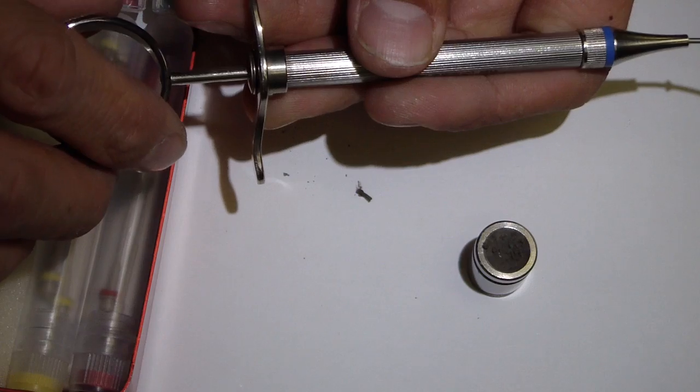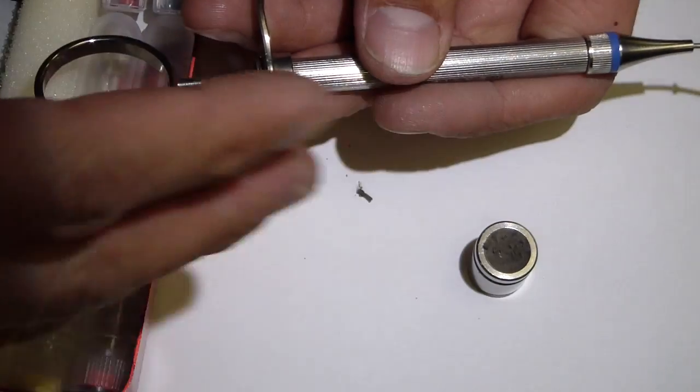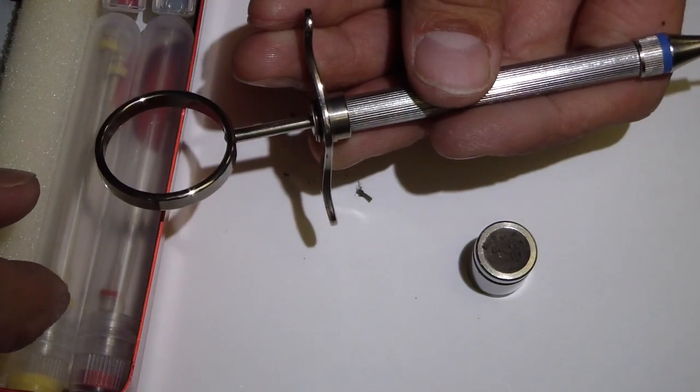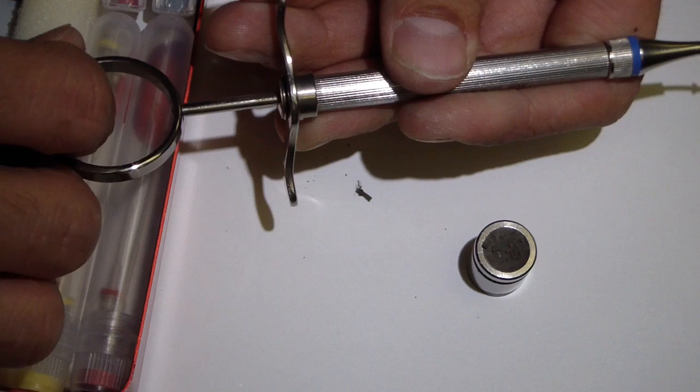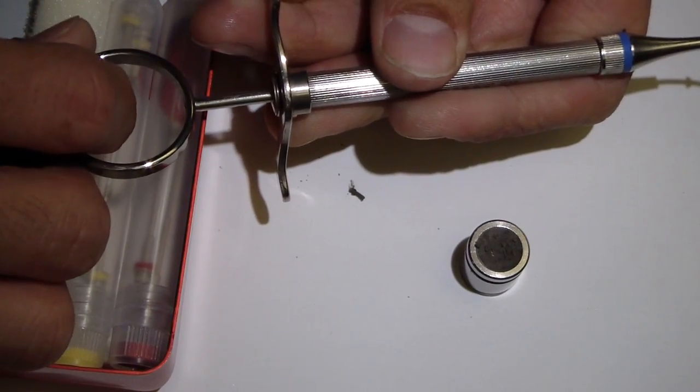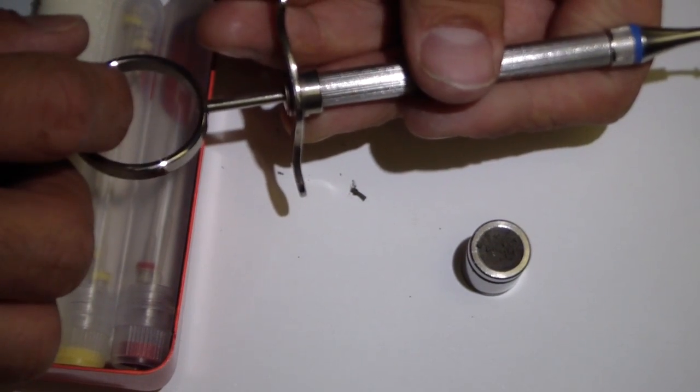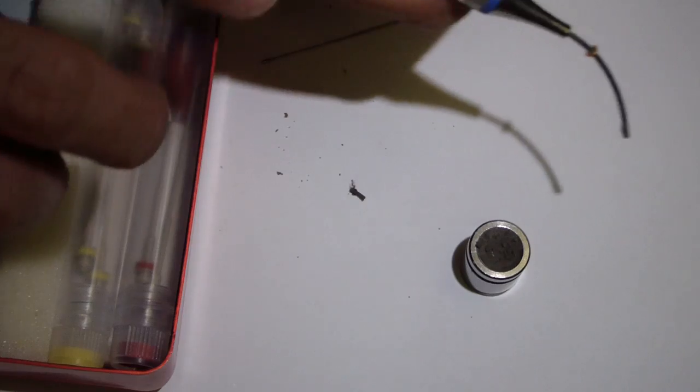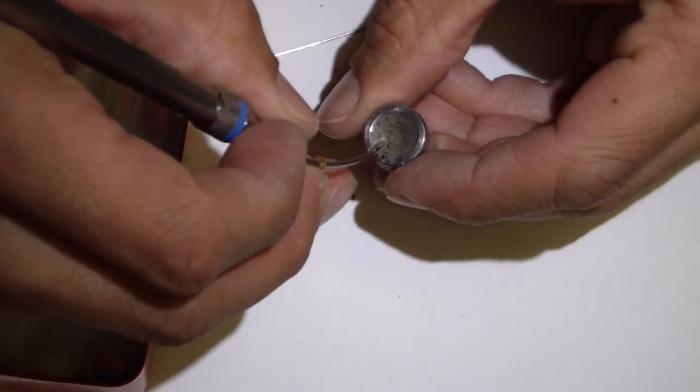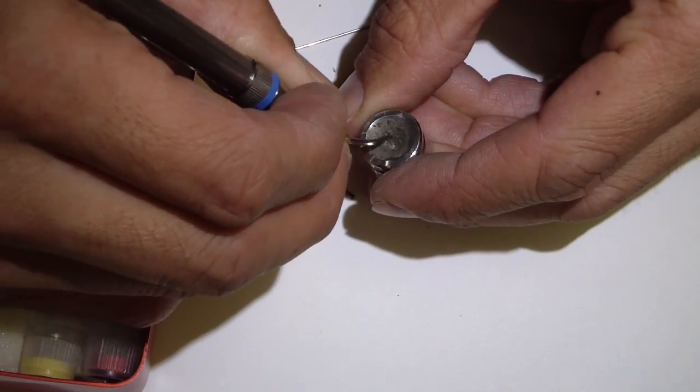I extruded my material, and then I neglected, because what happens is with time MTA builds up in the tip, so I didn't pull back on it. So nothing actually got filled in there. I apologize for wasting a minute of your time.